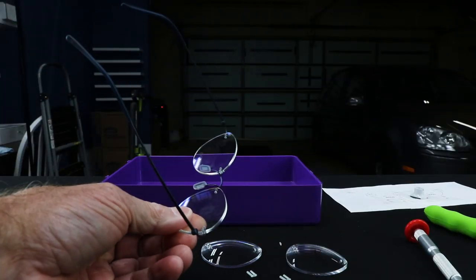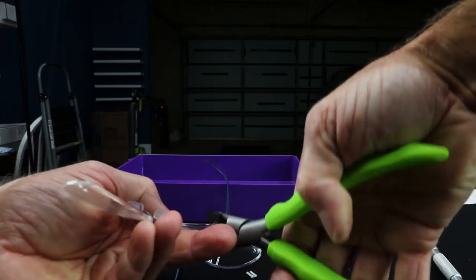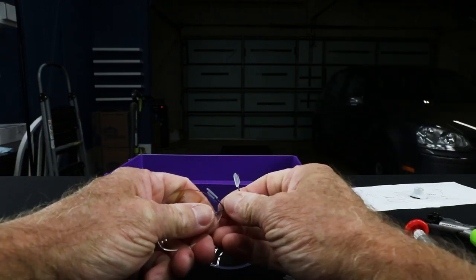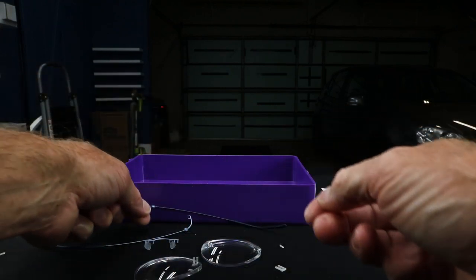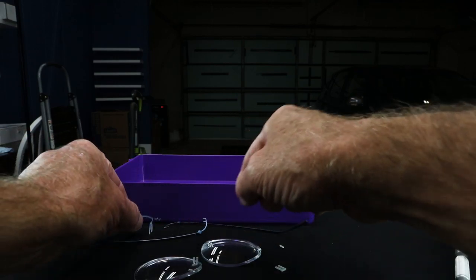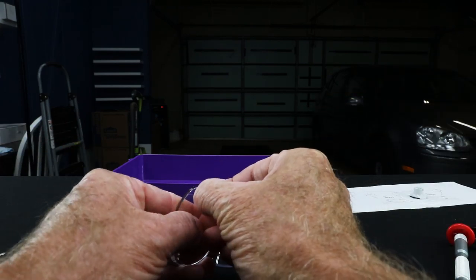It really doesn't want to pull apart easily, so let's switch to this tool. Got those all cleaned up — no more bushing pieces left on them anywhere. That is generally how a frame would come to you from the factory. You don't generally get a three-piece mount with demo lenses in it, so you usually don't have to take it apart. Now we can go ahead and put our bushings in.